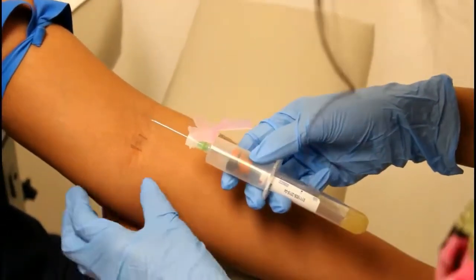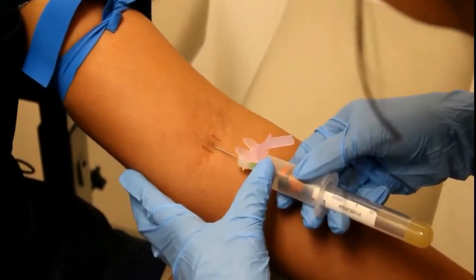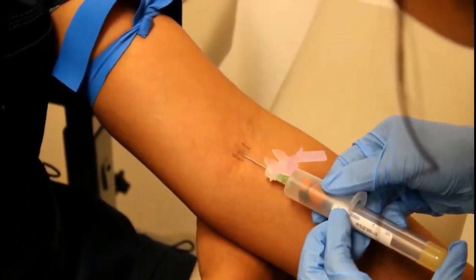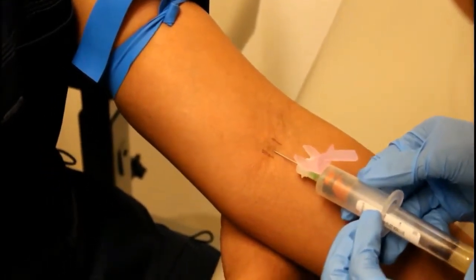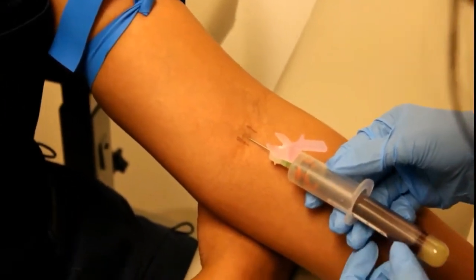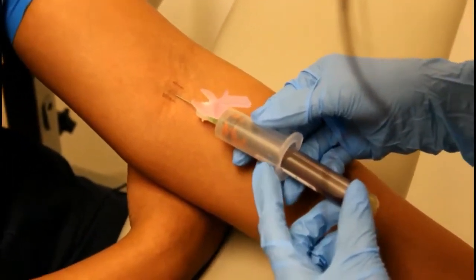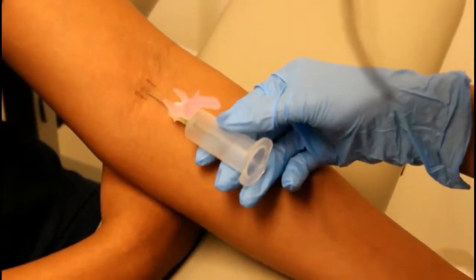Then with the bevel facing up at approximately a 30-degree angle, because we are using a straight needle, you won't know if you are getting a flashback. With the vacutainer ready in the hub, push in to collect your sample. You'd want to try and fill 3/4 of the tube. Then steadily remove the tube, not the needle, and place the next tube.